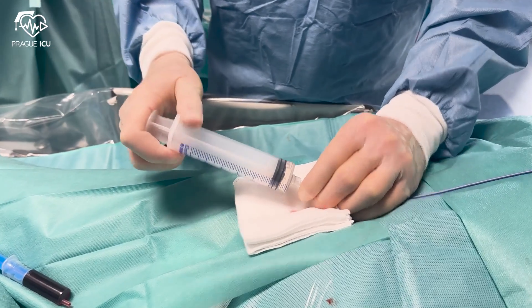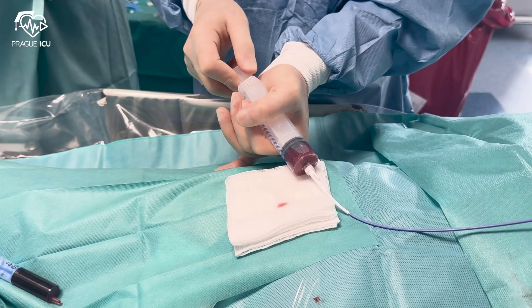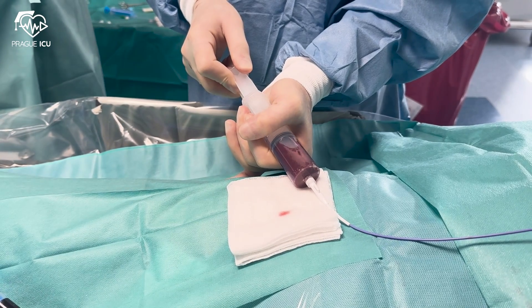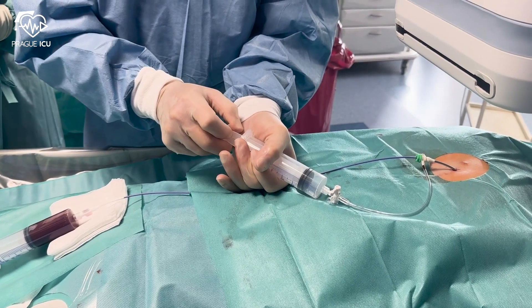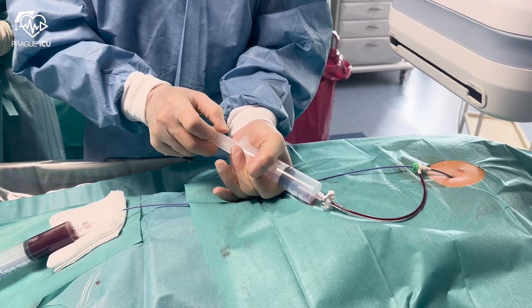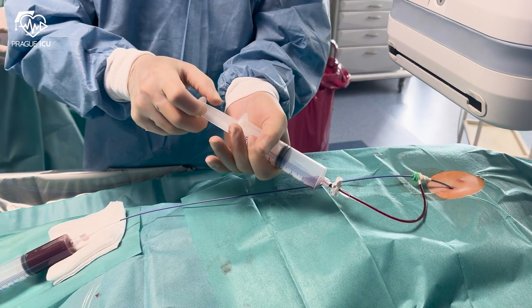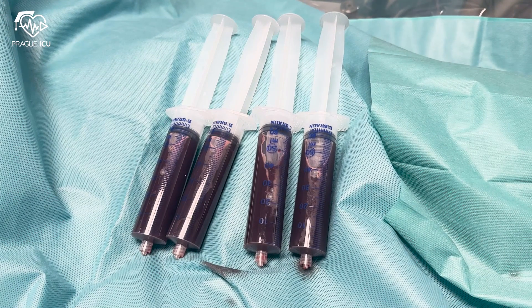Aspirate the fluid. Through the side port of the sheath, you can either aspirate or measure the pericardial pressure. Aspirate the majority of the pericardial fluid and send at least 150 ml to the lab for analysis — including biochemistry, blood count, cytology, and microbiology.